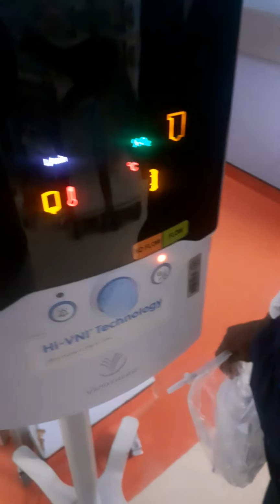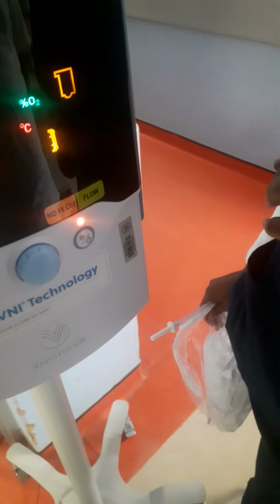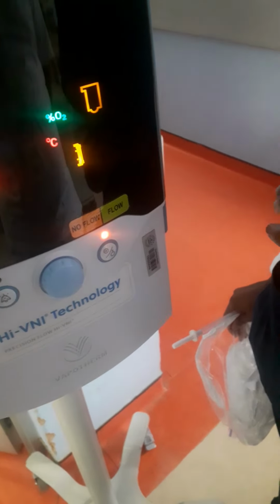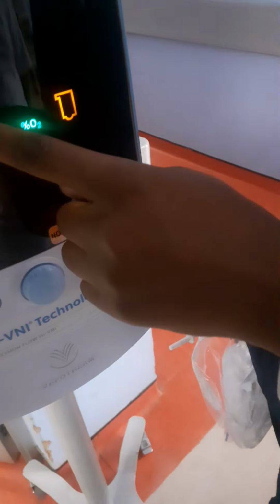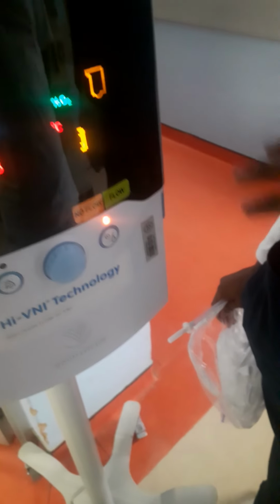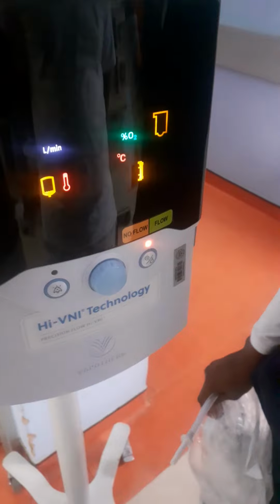You multiply by 2, and then you take the lower number. For example, if it's 7 times 2, it's going to give you 14, and then you're going to take the lower, 12. Yeah, I saw that formula somewhere. That works for kids.